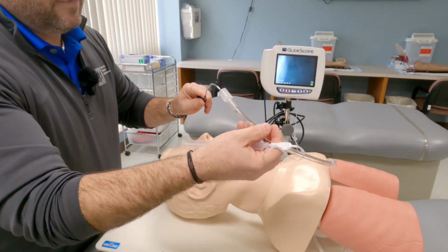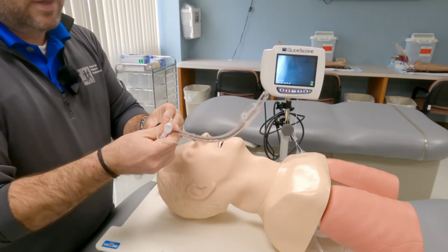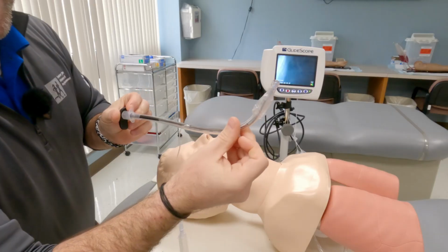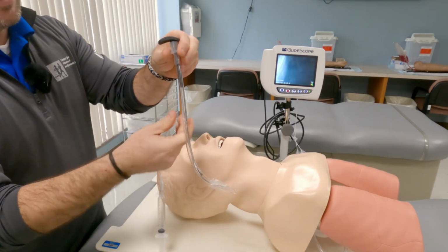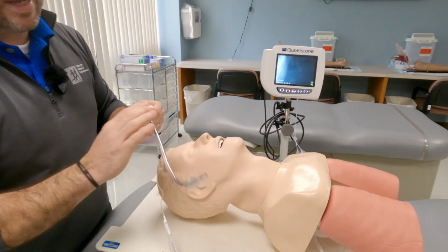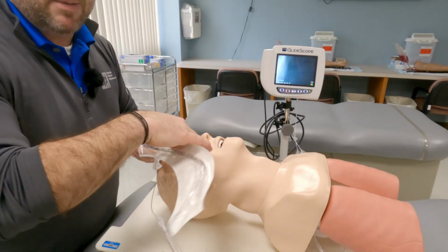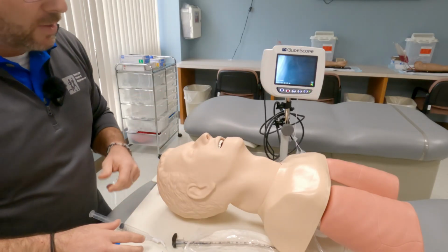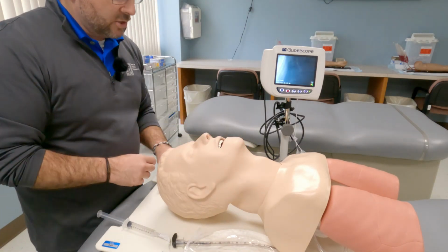Insert the rigid stylet inside the endotracheal tube. As it goes down, you see it ends just before the Murphy's eye, but it's all the way to the hub, so that's exactly where you're going to put it each time. So this is ready to go. Probably going to use some lubricant, maybe keep this inserted inside the package so we can do our intubation. Now, we're not going to show any of the pre-oxygenation aspect of it. We're going to get straight into it.